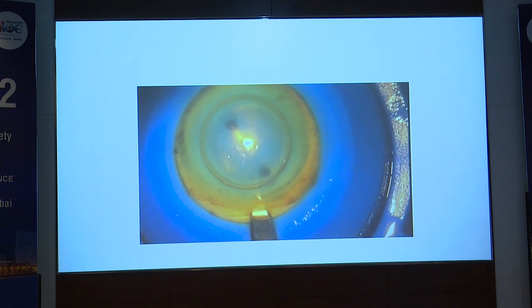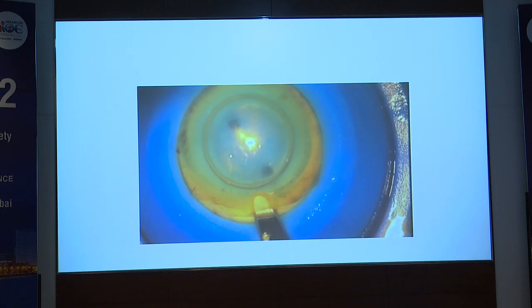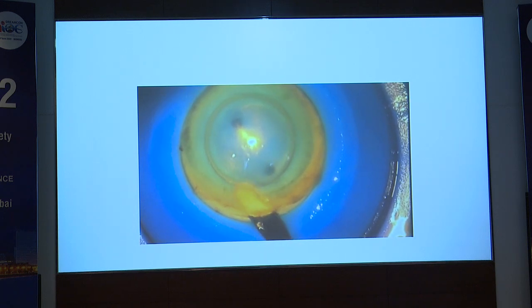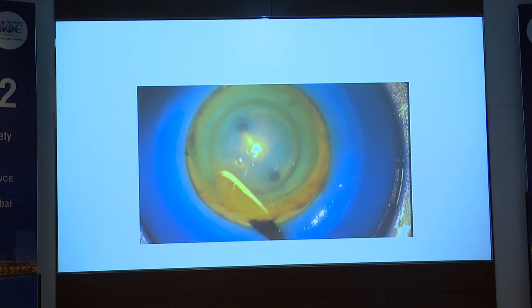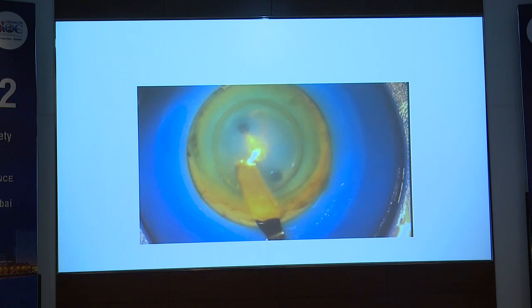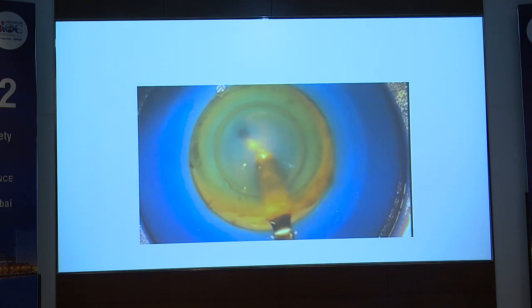And even that does not require any special instrumentation. So all we can do is just mount it on an artificial anterior chamber, pressurize it properly, make a 400 micron groove, and you can use your crescent blade to do a dissection, just similar to the way you would do for an SICS.